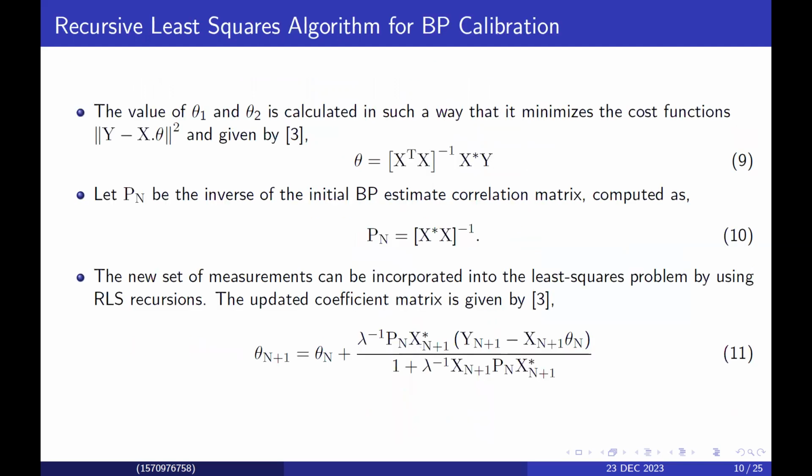Now we employ the recursive least squares algorithm for BP calibration. Here we calculate the coefficient matrix iteratively as given by equation 9.